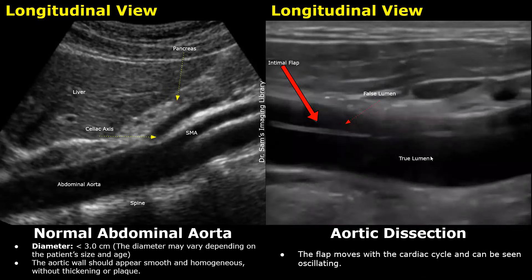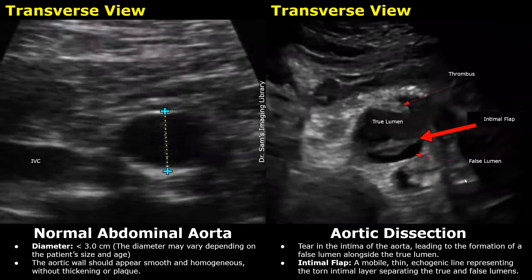Here is another image showing an aortic dissection. In real time, the flap moves with the cardiac cycle. This area is the false lumen and this is the true lumen of the aorta. Here is a transverse image showing a dissection — this echogenic linear structure is the intimal flap seen floating in the aorta. The false lumen is below the intimal flap and the true lumen is above it.